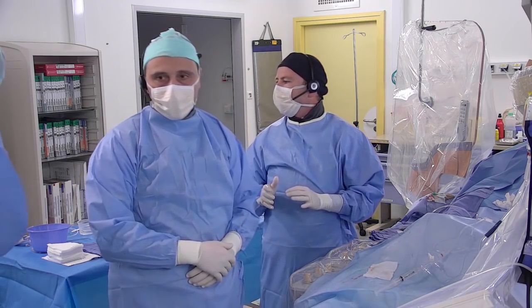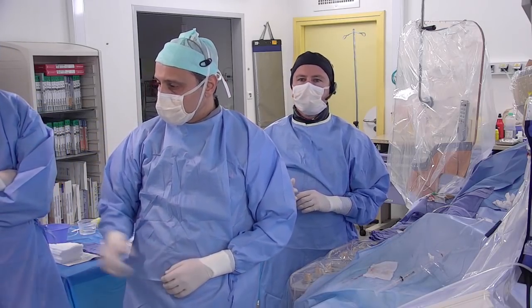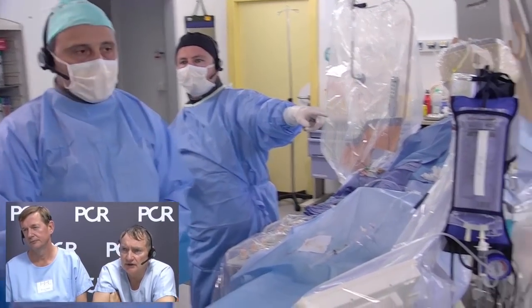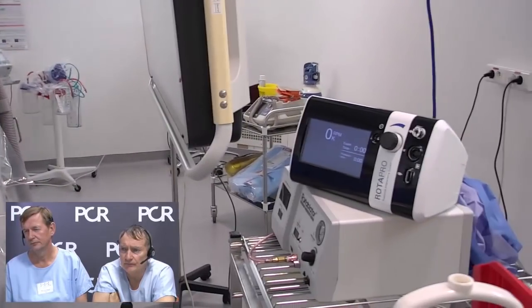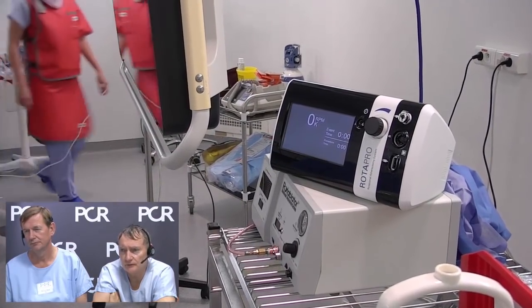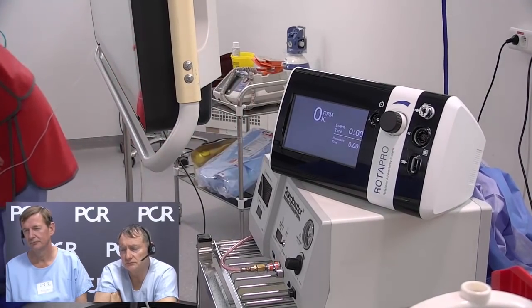This is the ROTAPRO. Could you show the old console of the rotablator and the new one, Jérémy, to explain the differences between both? Yes, give us a second, Didier. We will just turn the camera towards the console. You have the two of them: the old one below, the dinosaur, the previous version, and the new one above, which is much more catchy.